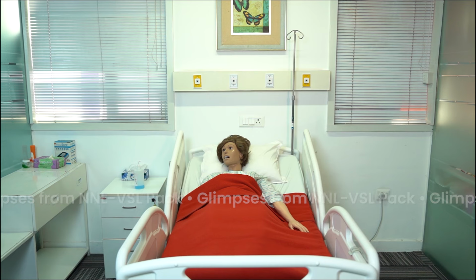The main indications are blood sampling, administration of the blood products, administration of the fluids, administration of the total parenteral nutrition, and the administration of the medication. So now with the help of the procedure demonstration, we are going to teach you how to insert the IV cannula. Enter the patient room.